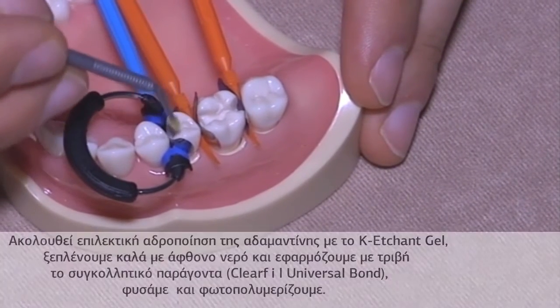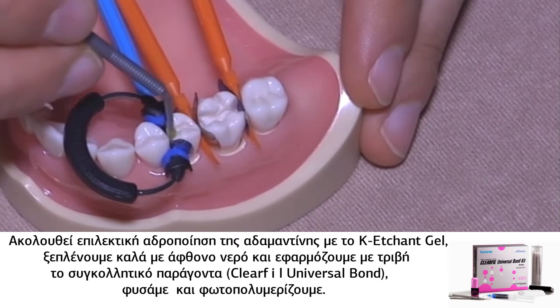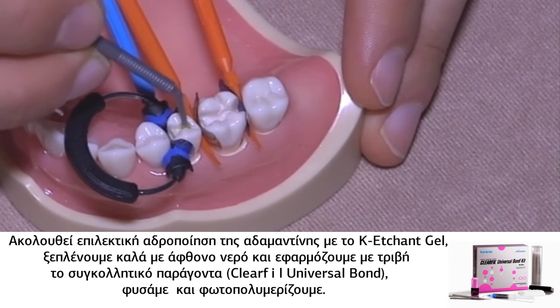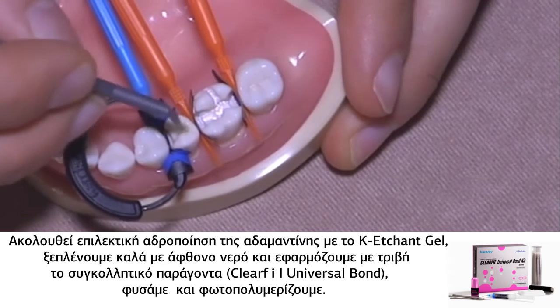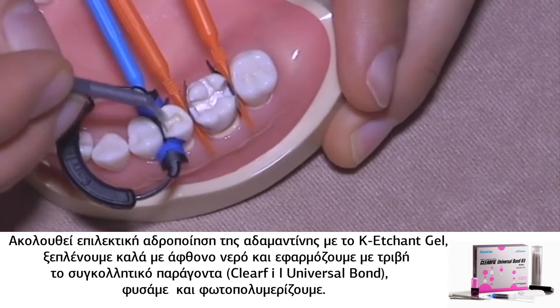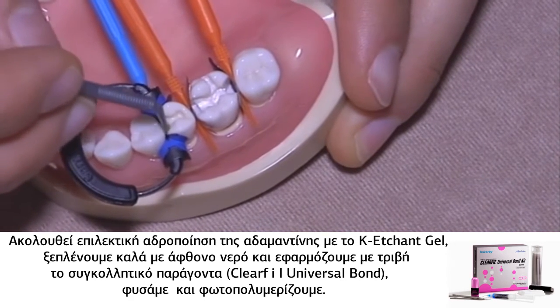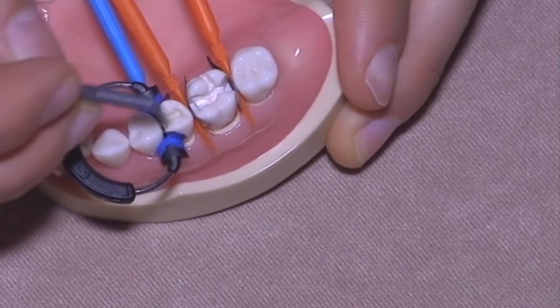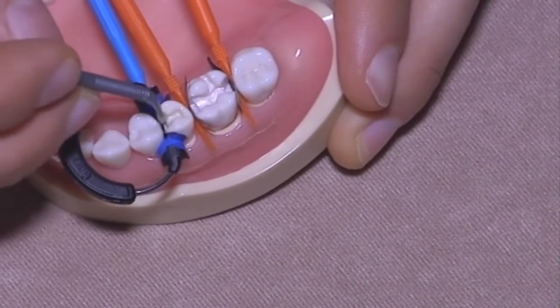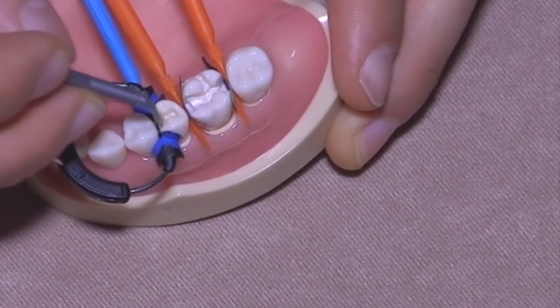We don't have enamel here, but selective enamel etching and then self-etch approach, because as I told you before, today the best option for dentin is the self-etch approach. It is less operator dependent, less post-op sensitivity, and less influenced by the expertise of the dentist.